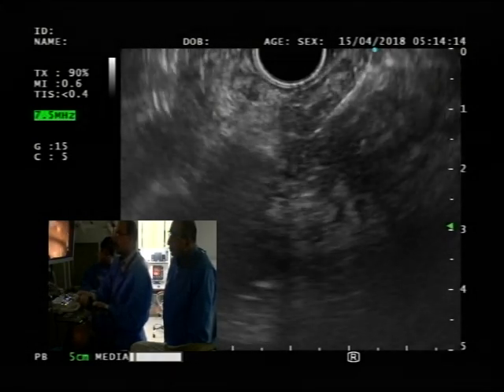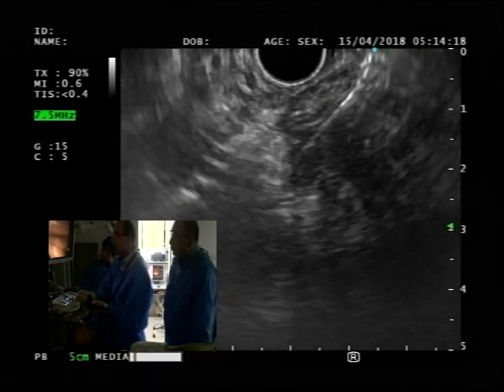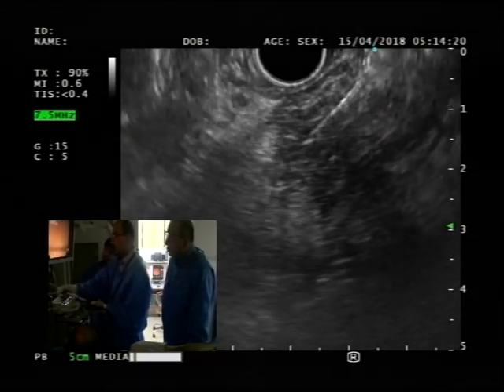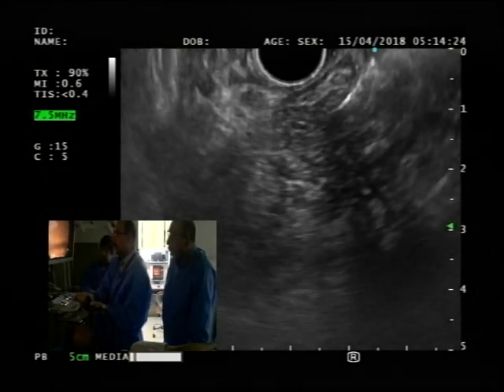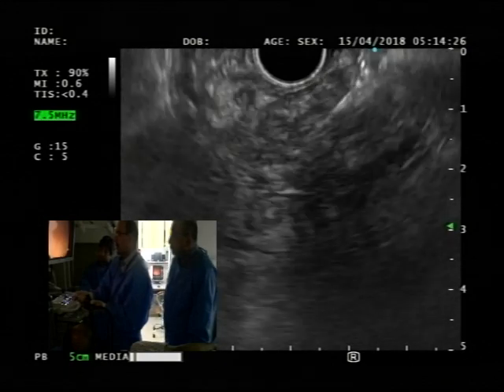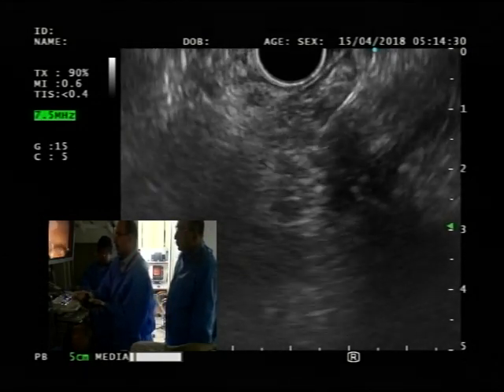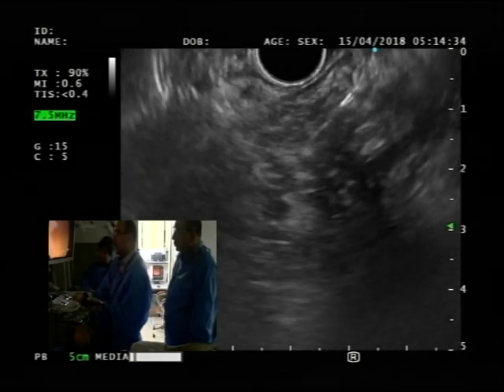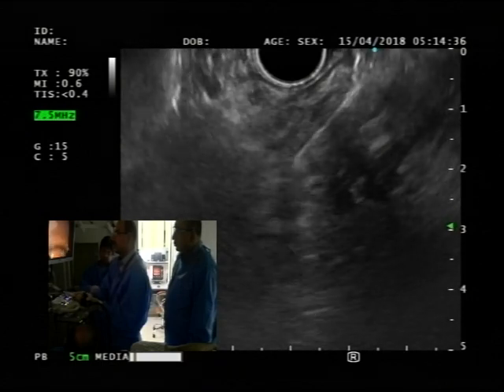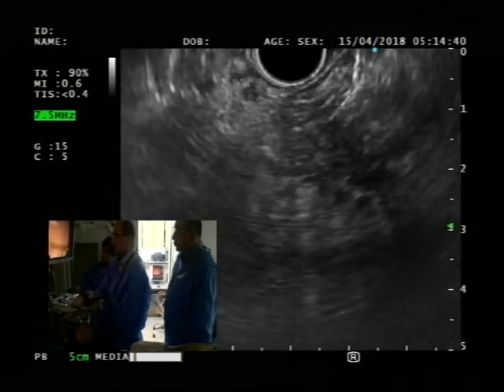And then you just do a sharp jab into the lesion, gently advance it further, unlock my suction, and do about 15 to 20 passes. We may be too close to the periphery, but I think we're okay.